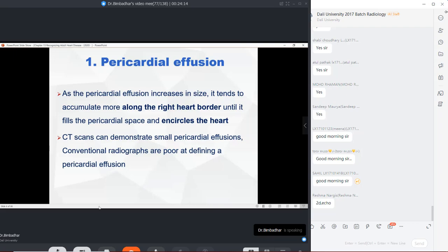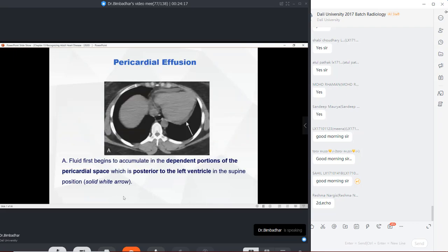All right. Okay. Now, how does it actually look? You see here, this is not a normal radiograph. Okay, this is an abnormal radiograph. You see here the heart shadow, which is a homogeneous hyperdensity. See here, this is a homogeneous gray shadow.